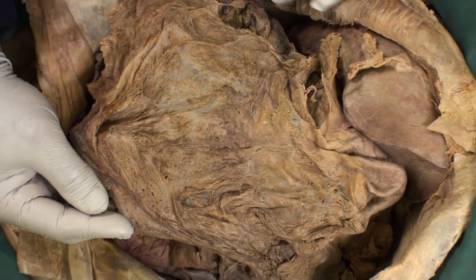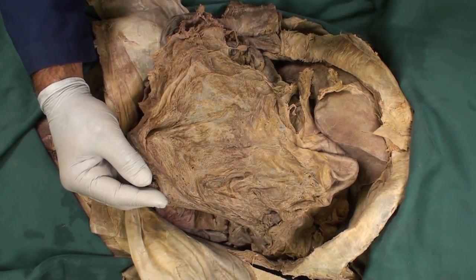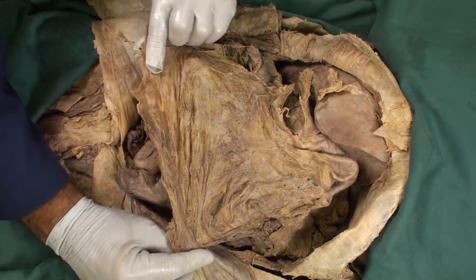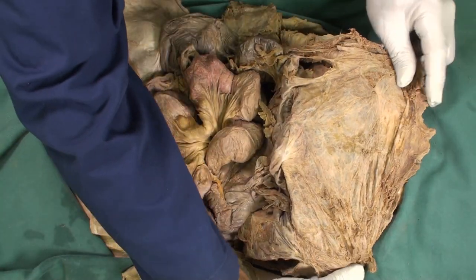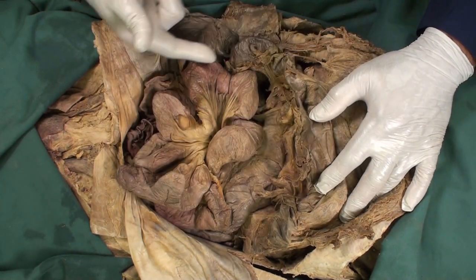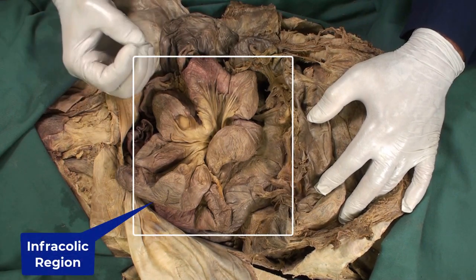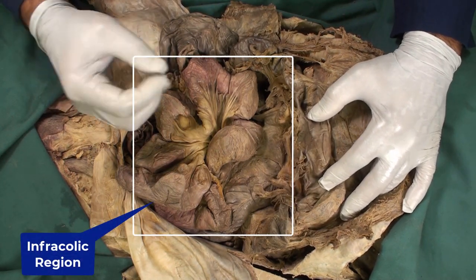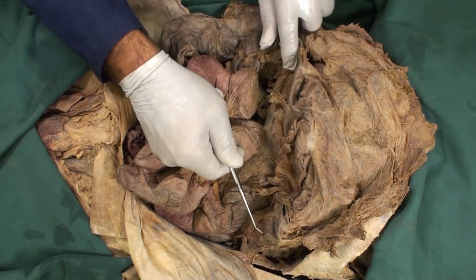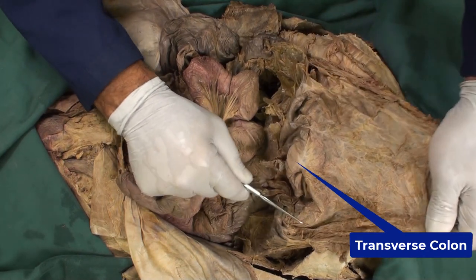The next step in the peritoneal cavity exploration is to hold the greater omentum and pull it up. We are now looking at the area referred to as the infracolic region. In this region, we can see the transverse colon right there. The transverse colon is attached to the greater omentum.